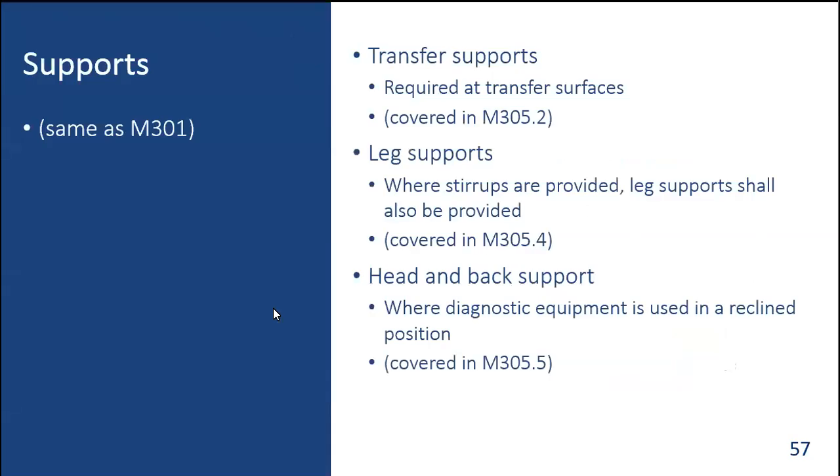The requirements for supports are the same as in M301 and require transfer supports at transfer surfaces, leg supports where stirrups are provided, and head and back support where the diagnostic equipment is used in a reclined position.